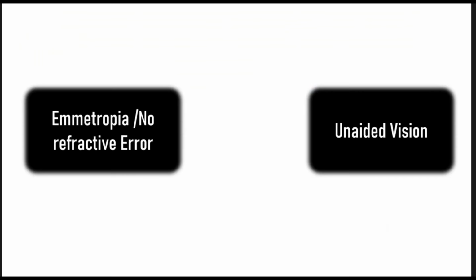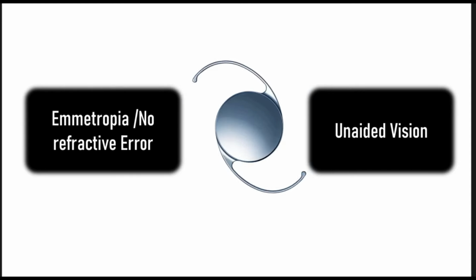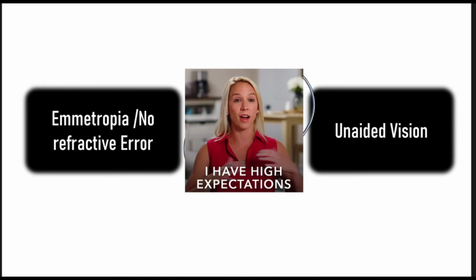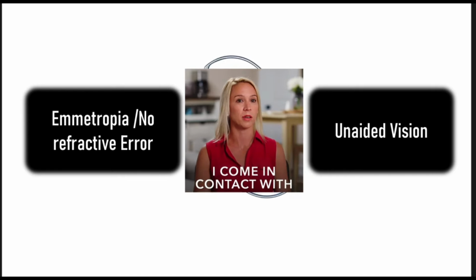With technological advancement in cataract surgery and the introduction of premium IOLs, patients' expectations have risen, and therefore they now aim at getting no refractive error following cataract surgery. Any refractive error is no longer tolerated. Therefore, it's very important that we carry out our IOL power calculation and biometry accurately.